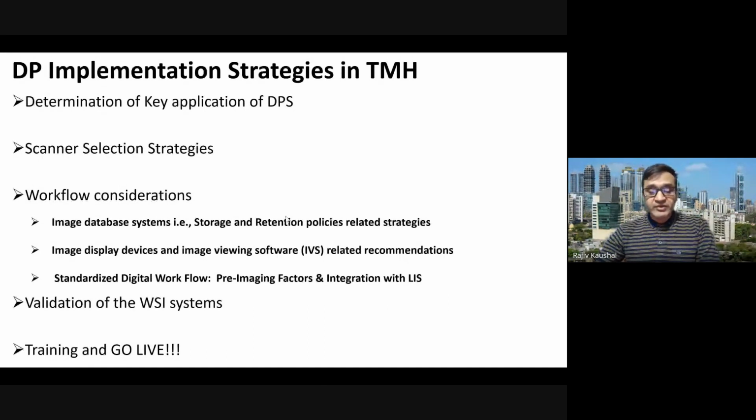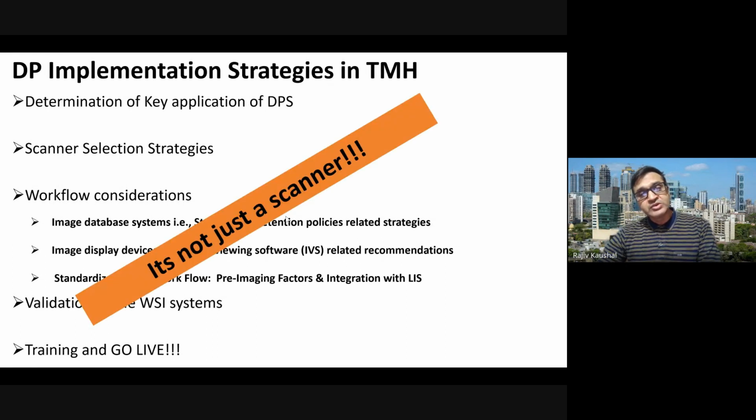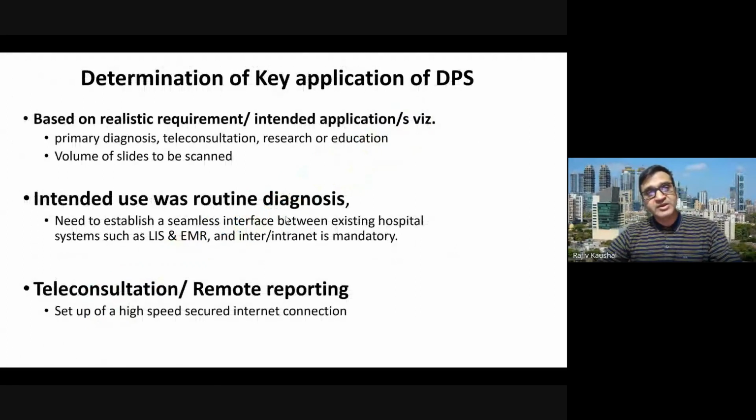And when you are set up with all these things, then you have to go with the validation and training of the pathologists, and only then can you go. So it is not just a scanner. You have to keep the other things in mind also. Unless you give attention to the storage and the routine workflow, the digital solution will not be complete.